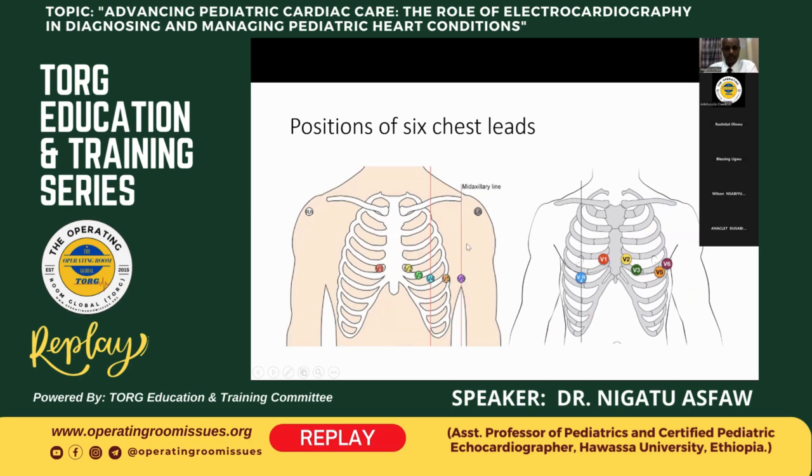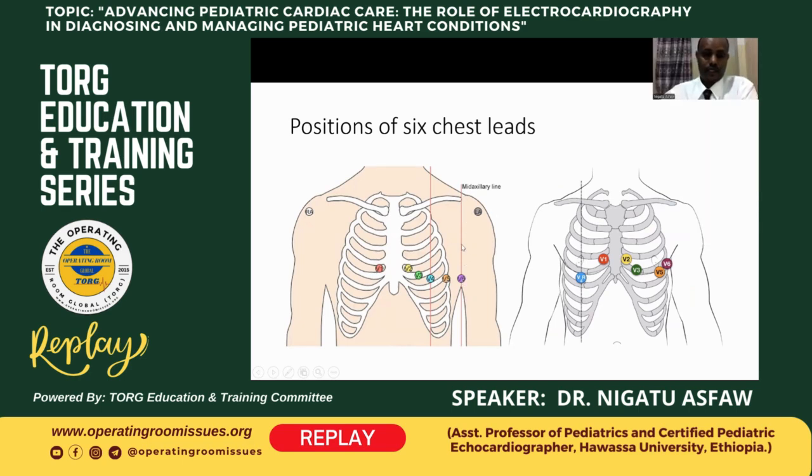V6 is put on the left mid-axillary line, and we put the V5 electrode between V6 and V4, and additionally we put V4R in order to evaluate the right ventricle activity electrically on the right side opposite to V4.